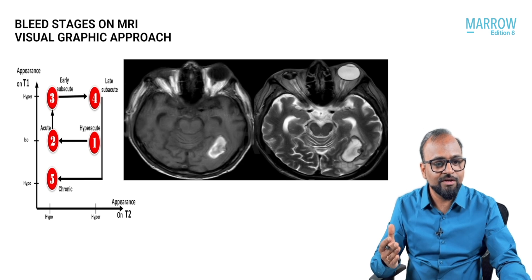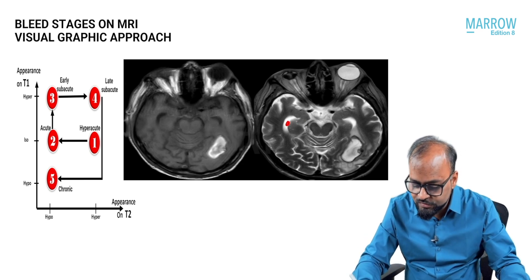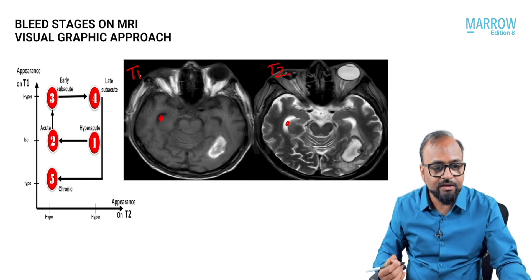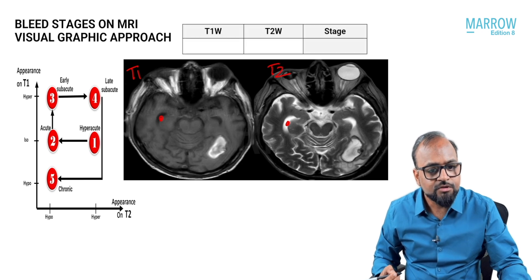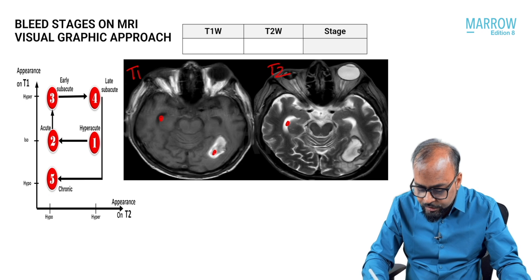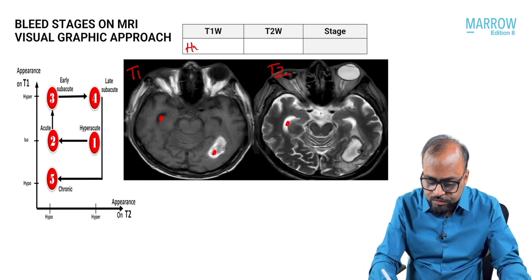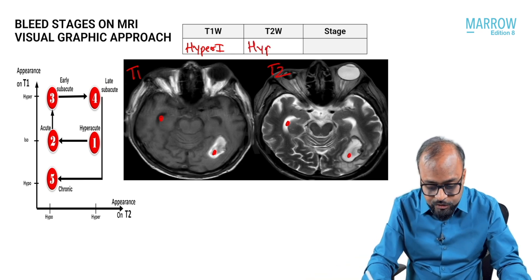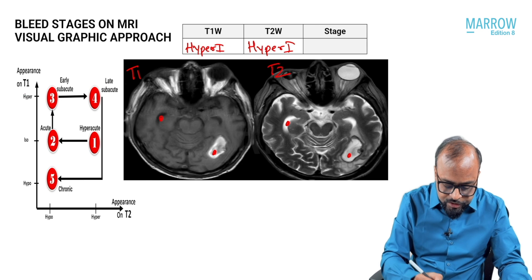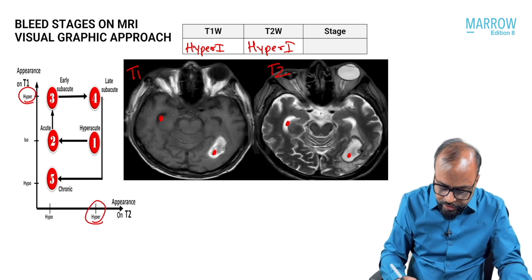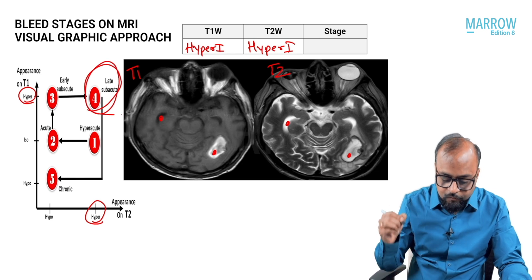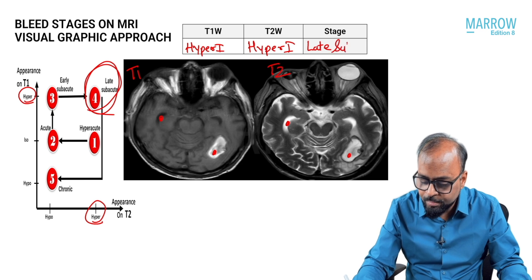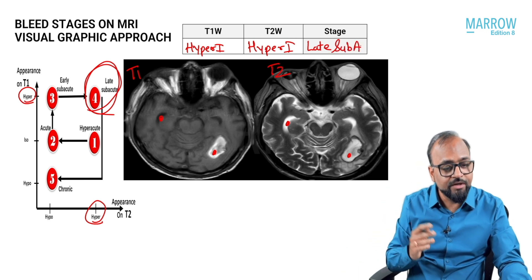Looking at these two images: CSF is bright on T2 and dark on T1. The lesion appears bright on T1 — hyper-intense — and also bright on T2 — hyper-intense as well. A lesion hyper-intense on both T1 and T2 is at point number four on the graph: the late subacute stage of bleed.